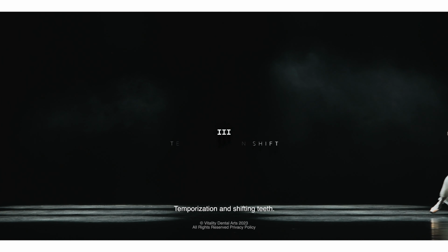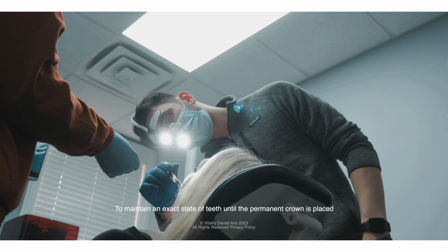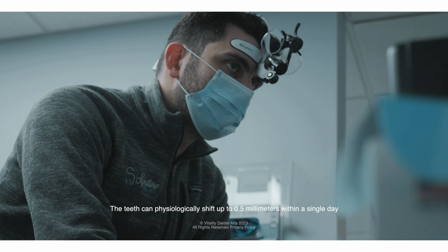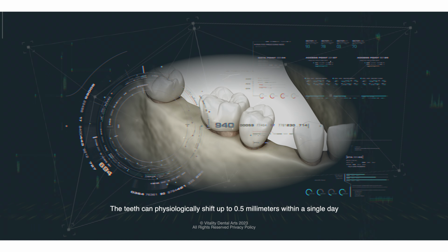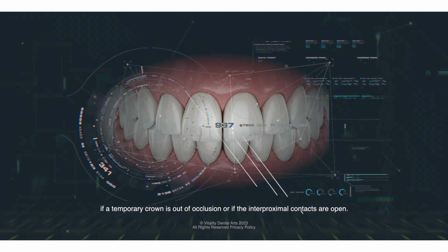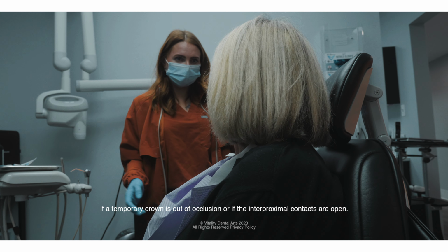3. Temporization and shifting teeth. To maintain an exact state of teeth until the permanent crown is placed, the temporization must not be overlooked. The teeth can physiologically shift up to 0.5 millimeters within a single day, rendering the initial obtained records useless if a temporary crown is out of occlusion or if the interproximal contacts are open.